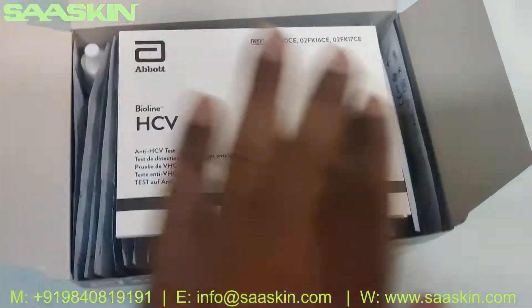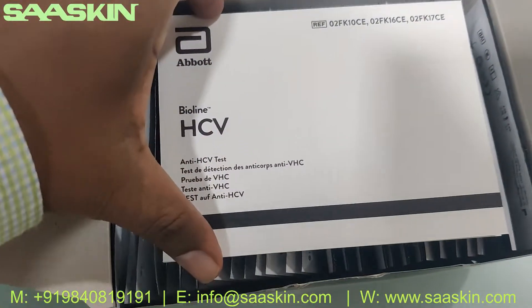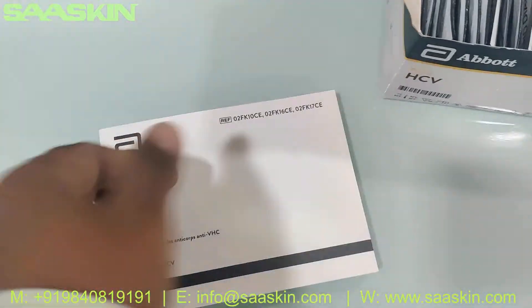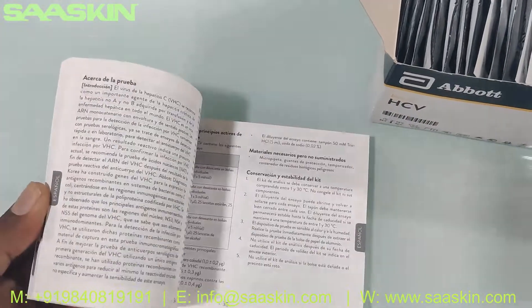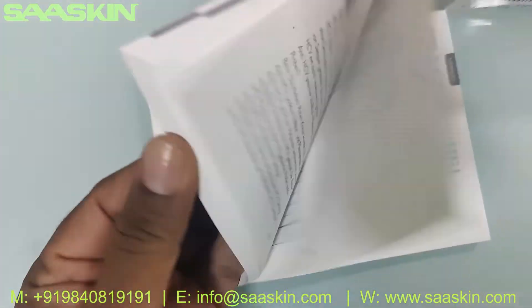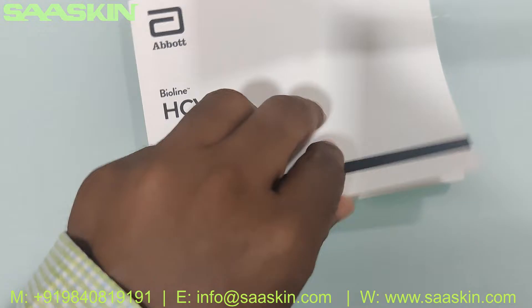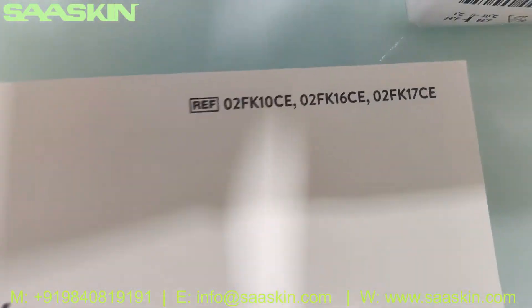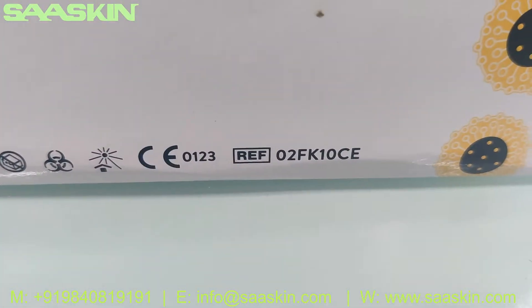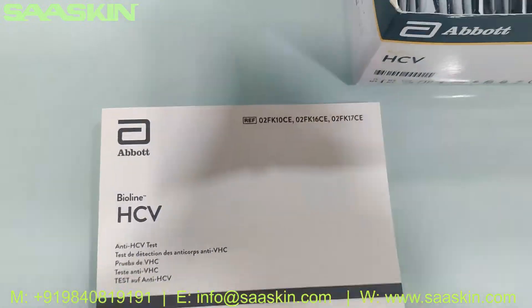Okay, inside the box you can see you get a booklet — it's a booklet which gives you the instructions about the complete test: how to prepare for the test, how to conduct the test, and how to interpret the test. These are the reference part numbers — let me show the reference part number here, here it is.